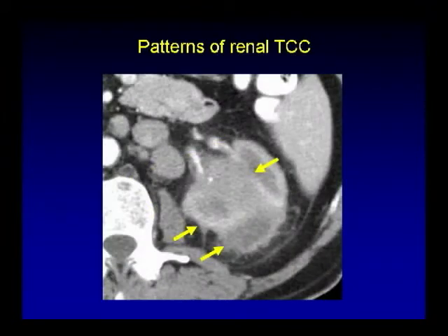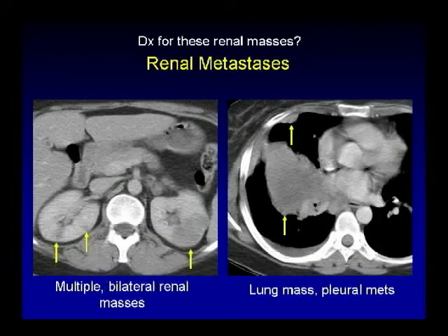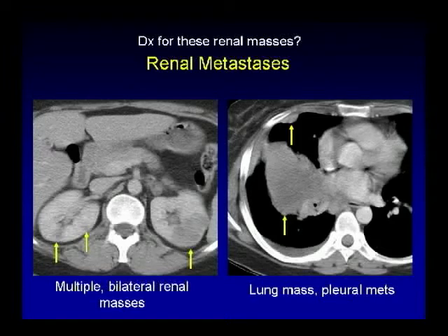Here's a case of an infiltrative mass involving the left kidney — another pattern of renal TCC. Here's another case with an ill-defined mass in the left kidney. It may represent renal cell carcinoma, but the infiltrative nature indicates you should include renal transitional cell carcinoma in the differential. Now here we see multiple ill-defined masses in both kidneys. Differentials: multifocal RCC, metastasis, or lymphoma. Look higher up — there's a large lung mass and pleural metastasis, so this is renal metastasis.